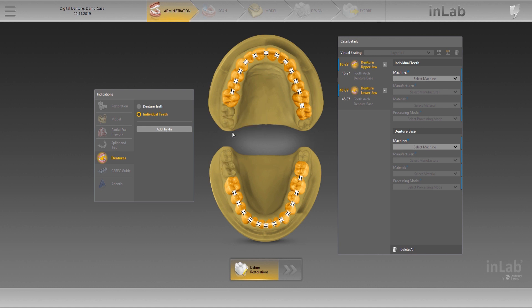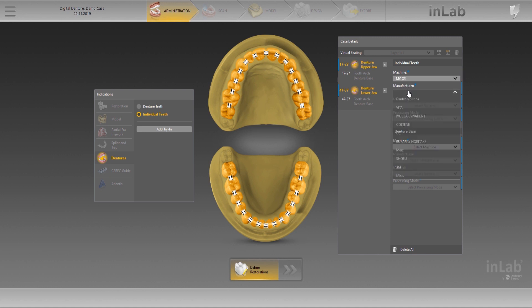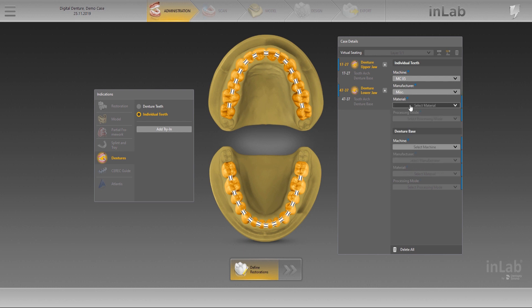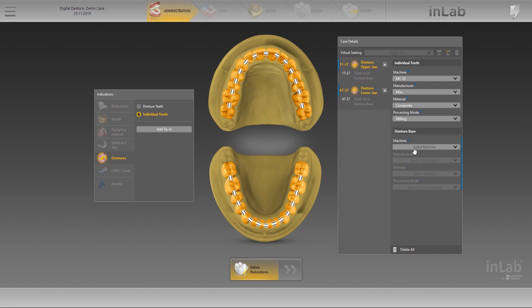You now have the option to individually select which second molars should be omitted or kept. You can choose between Delete Single, Delete All, and Delete Antagonist. These molars can be added back again if desired. The created denture is displayed in the case details as an upper jaw object and a lower jaw object, each consisting of two sub-objects: a tooth arch and denture base.